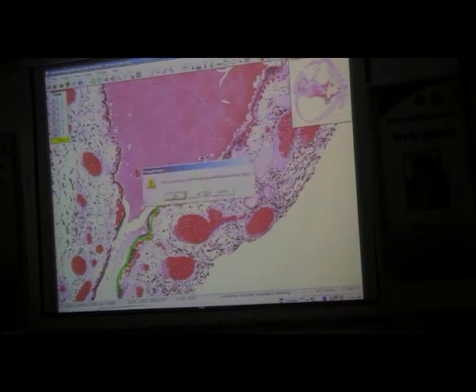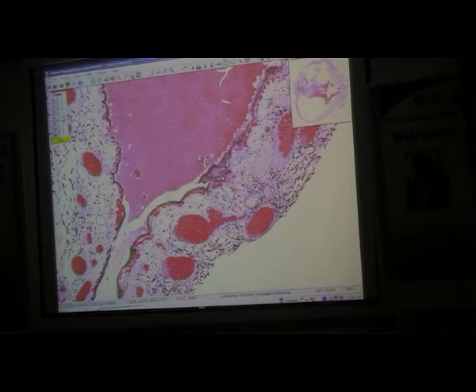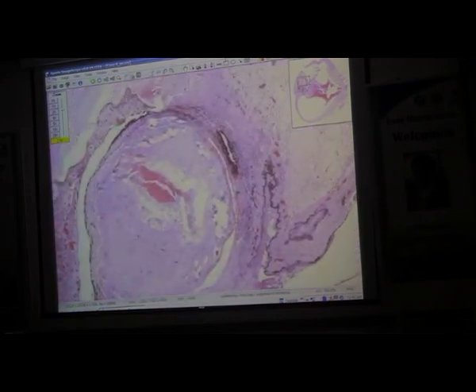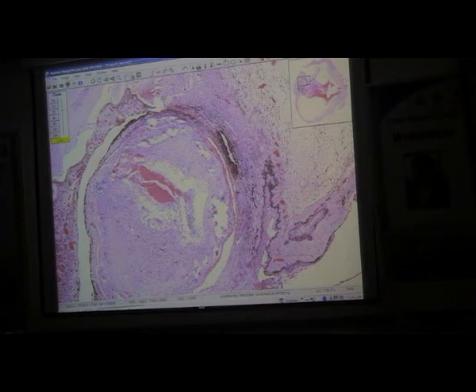These are choroidal folds, which is more evidence that we have a very low intraocular pressure in this eye. Now, there's a lot to say about this eye, but I'm going to focus for you on the lens. And when I focus here on the lens, you can see there isn't very much lens. You can see what is left of the lens.